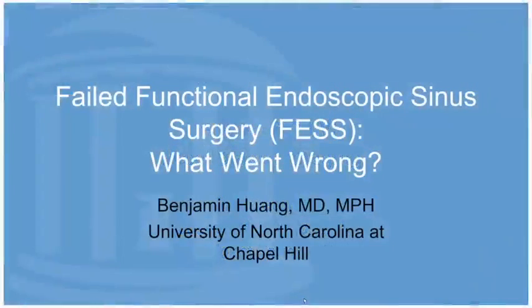Hello, I'm Ben Huang from the University of North Carolina. To finish out this session, I'm going to be talking about functional endoscopic sinus surgery with a focus on a few important causes of surgical failure that we as radiologists may be able to identify on postoperative sinus imaging.